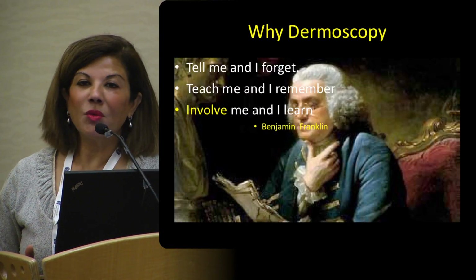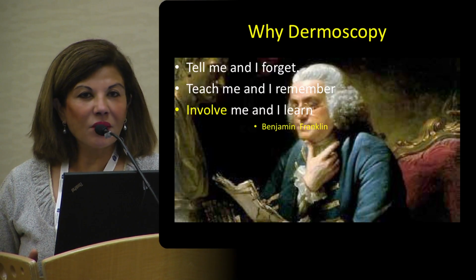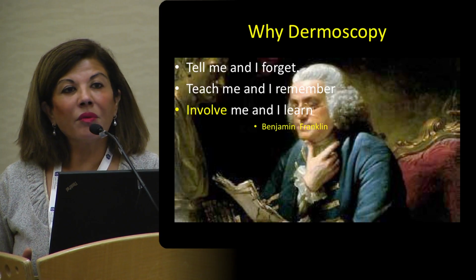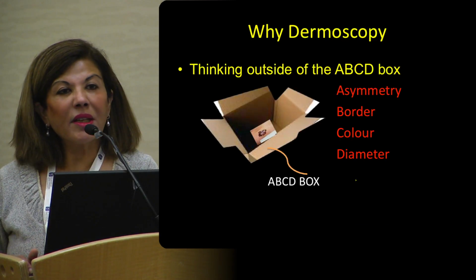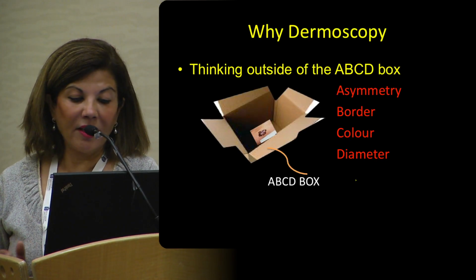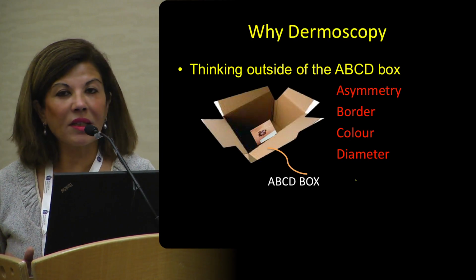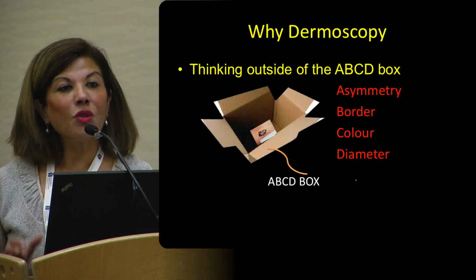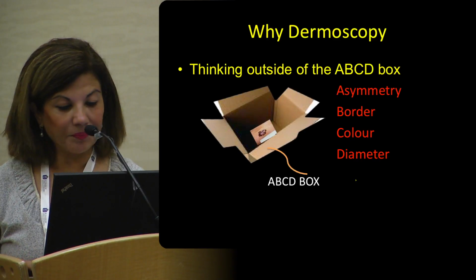Benjamin Franklin's famous words were, tell me and I forget, teach me and I remember, involve me and I learn. So one of my first goals today is to give you the most up-to-date information on dermoscopy, as well as to involve you in some clinical cases so you can get the concept of dermoscopy. My second goal is to help you think outside the ABCD box. This is because the mnemonic ABCD, asymmetry, border, color, and diameter is now evolving, and it has been increasingly recognized that a lot of melanomas do not fit that ABCD criteria. But I'd like you to hold this thought for the next 5 to 10 minutes, and I'm going to come back to that later as I move along the presentation.